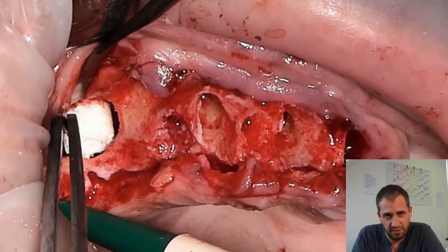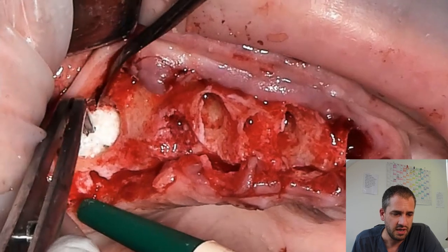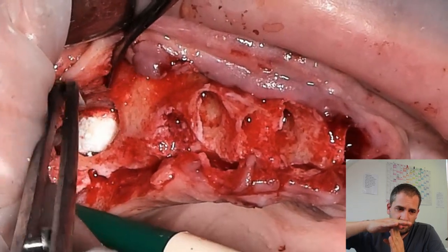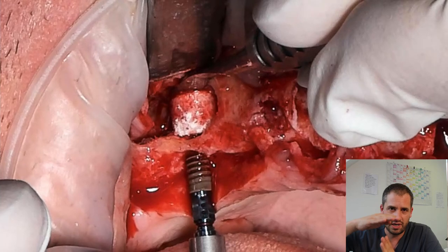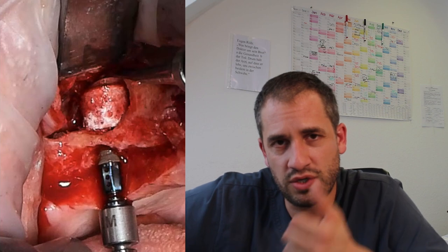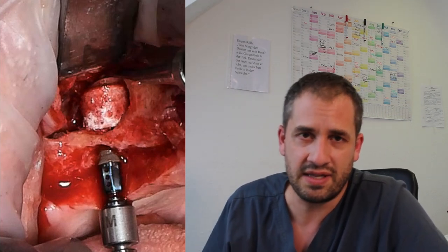Of course, before I did the implant drilling in the local bone, I place the allograft ring on top of the implant drill, and then I insert the implant into the sinus. You only have to do this when you want to place an implant directly and you have only a few millimeters left and can't get primary stability without this bone ring. When you can do an internal sinus lift without bone rings, it's better. But in this case, only one millimeter of bone was left.